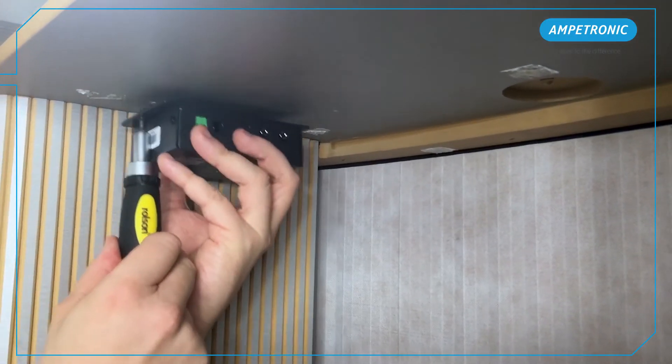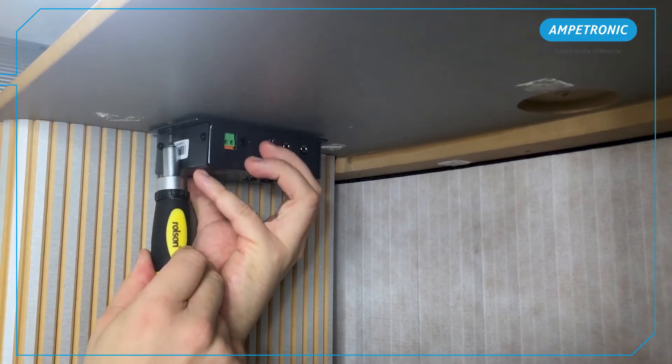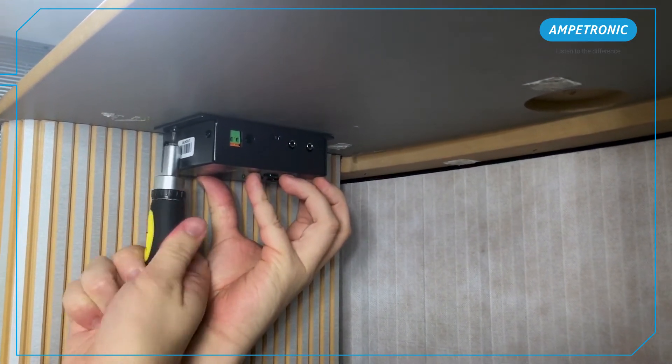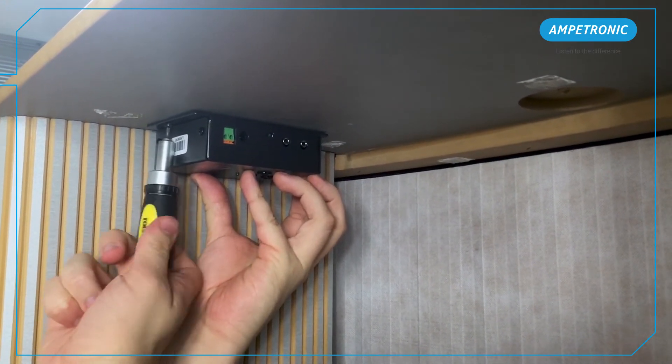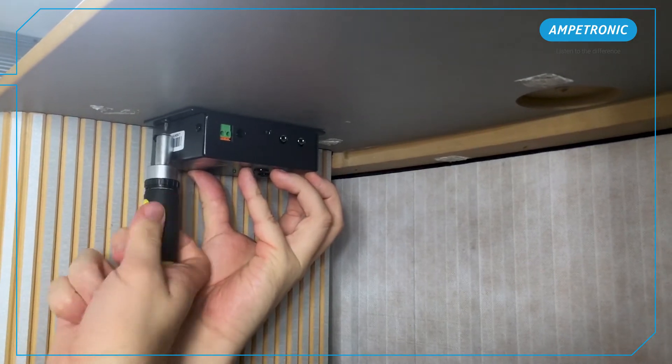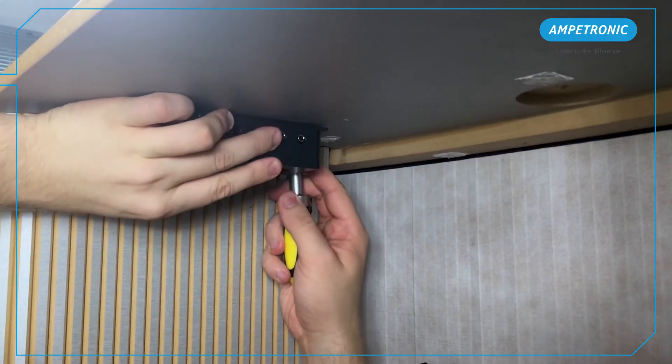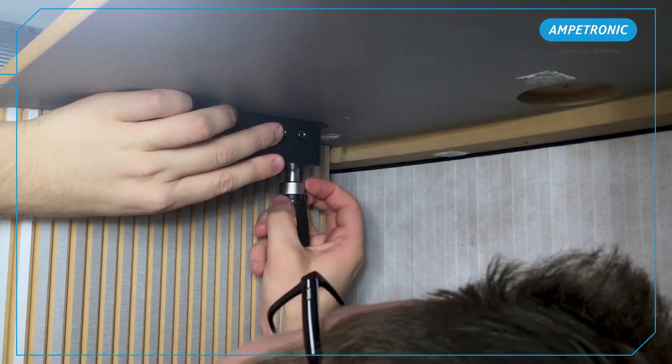You will need to install the amplifier in a location within close range of the intended loop position and the power supply. Make sure you have reasonable access to the amplifier for initial setup, but also for future maintenance and service tests. Two screws are required for fixing. The centre spacing of these is provided in the handbook.